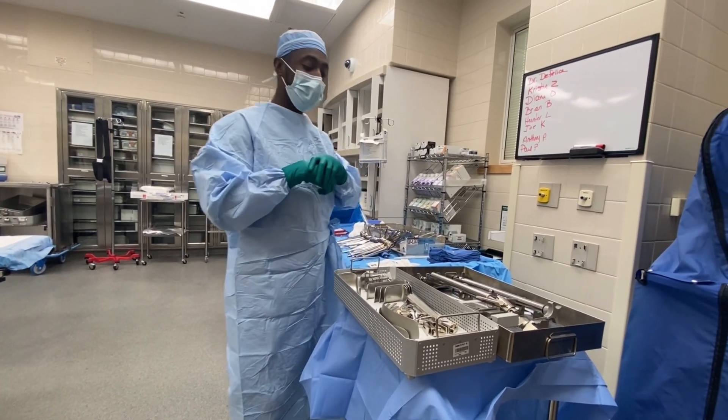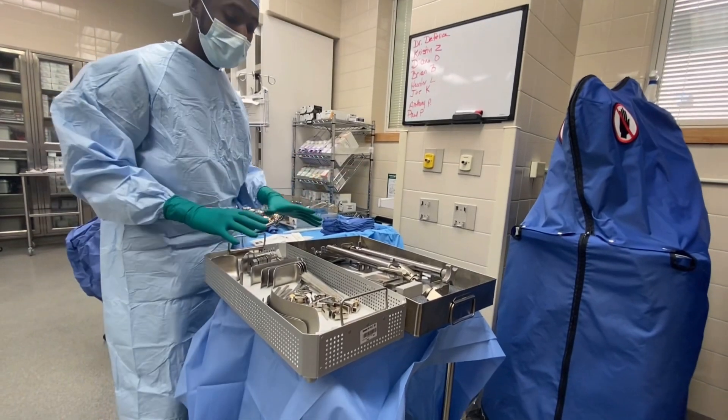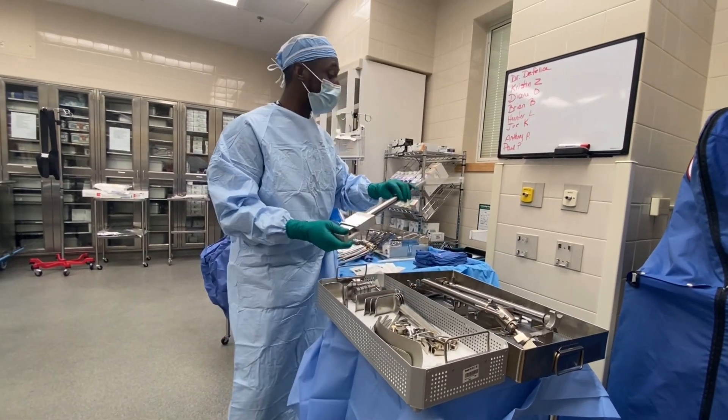What's up everybody, it's your boy the Surgical Guru and today we're going to talk about the Bookwalter retractor. I'm going to show you how to assemble it — what parts go first, second, third — so you can be prepared if you've never used it before.